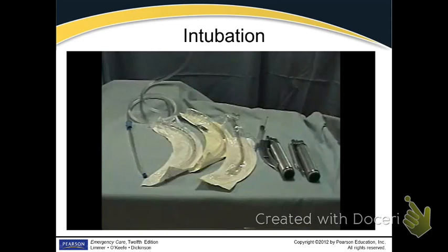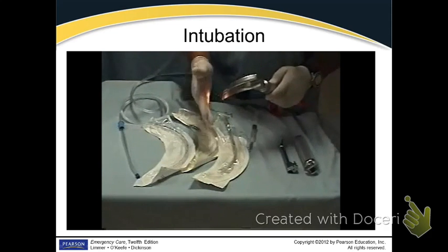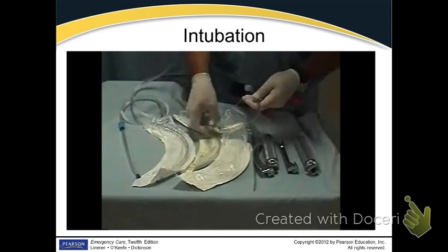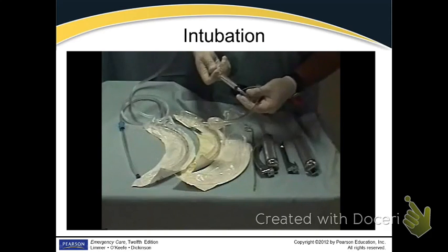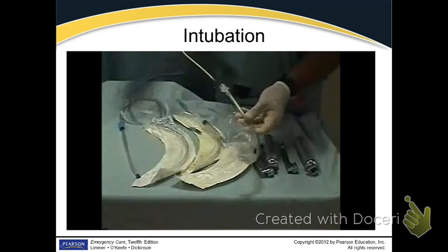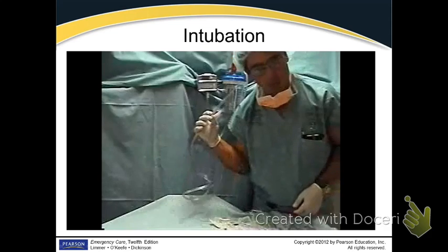Before attempting to intubate, you should check all your equipment. Lock the laryngoscope blade into the handle and test the light. Several sizes of endotracheal tube should be available. Test that the cuff is intact. A malleable stylet allows the endotracheal tube to be bent to any desired shape. Don't forget to check the suction.